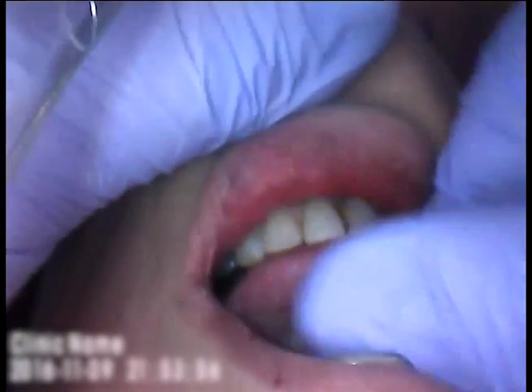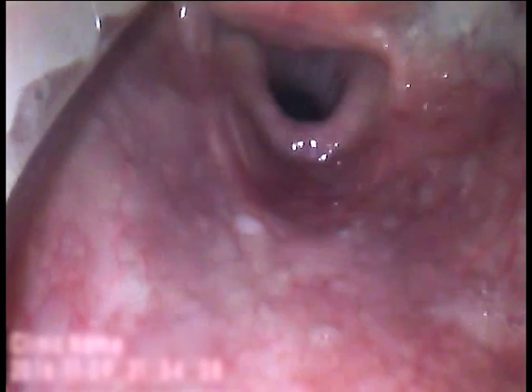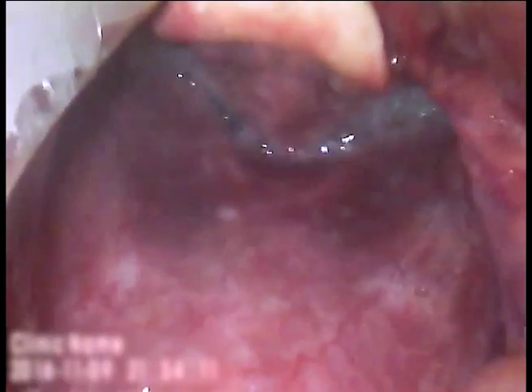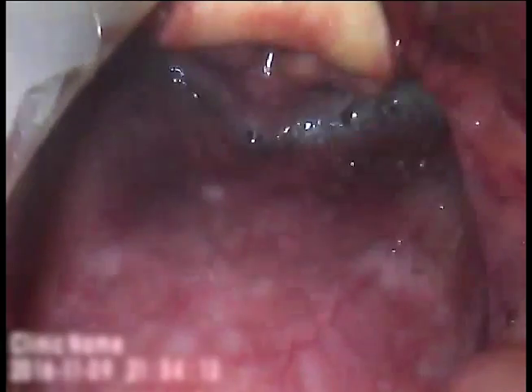During a routine laryngoscopy and intubation using a GlideScope AVL video laryngoscope, the first structures visualized — which to the inexperienced might appear to be the larynx — are in reality the esophageal inlet. This is learned after withdrawal of the video laryngoscope, when the true laryngeal structures are seen.